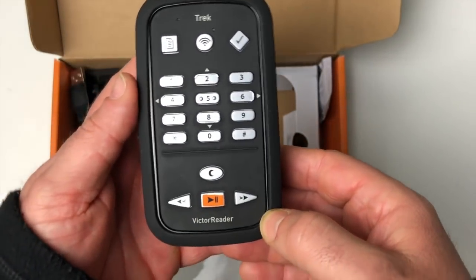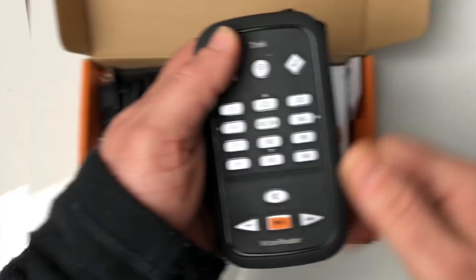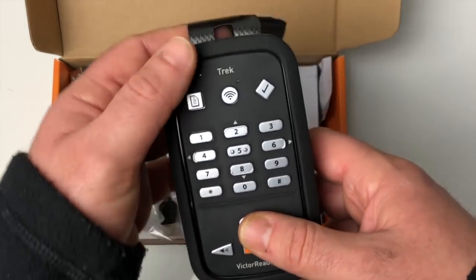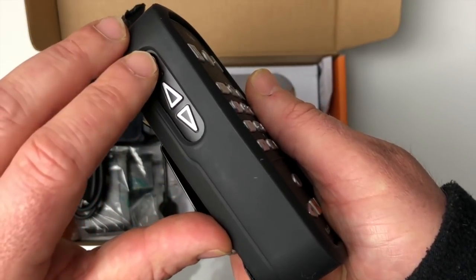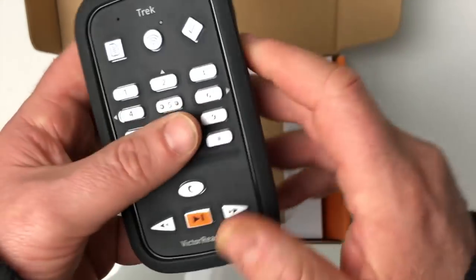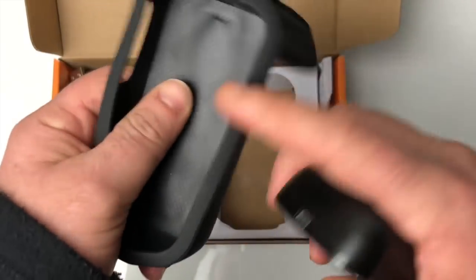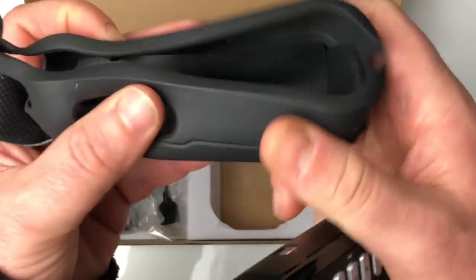Je vous le mets en très gros sur l'écran. Côté design, c'est une copie conforme du Victor Reader Stream : avec un pavé numérique, la touche carré play/pause, une flèche à droite et une flèche à gauche, le petit ovale qui permet de donner l'heure. C'est vraiment typiquement un Victor Reader Stream. Les boutons de volume à gauche, le bouton marche/arrêt et le bouton dictaphone sur le côté droit. On peut facilement enlever l'appareil puisque la coque qui l'entoure est une coque molle, très bien faite, qui entoure et protège complètement l'appareil.